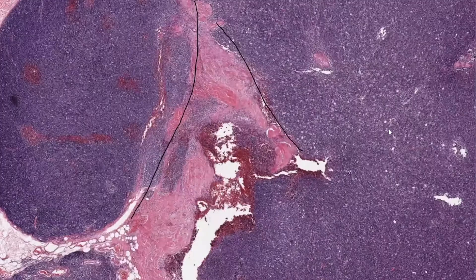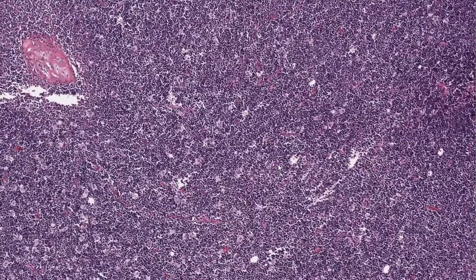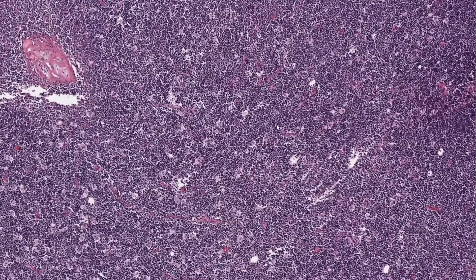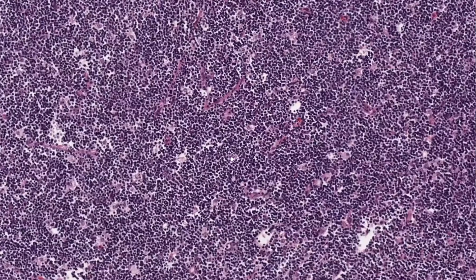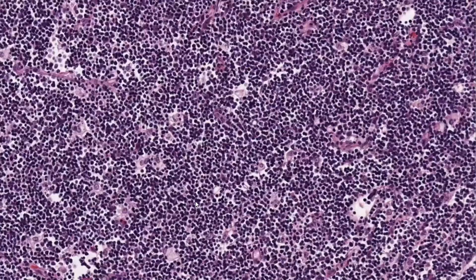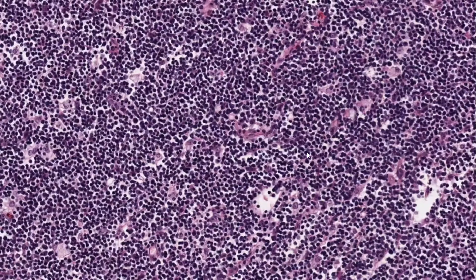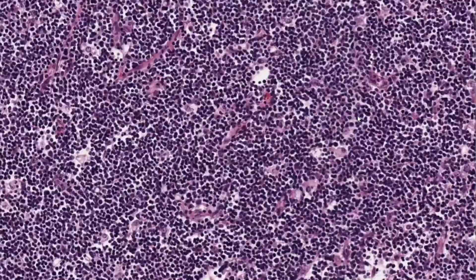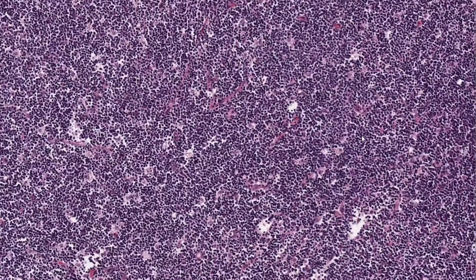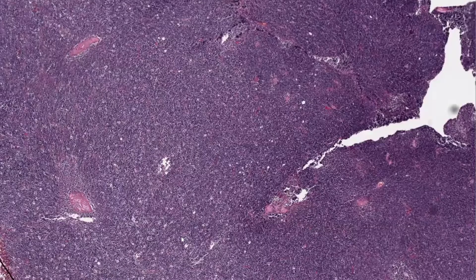In terms of thymomas, we subtype them in a WHO system into A and B thymomas. This is a B thymoma as we have numerous lymphocytes and interspersed epithelioid cells. This would be a B1 because we just see these single interspersed epithelioid cells and we're not really seeing clusters or sheets of epithelioid cells as we would see in a B2 or B3 thymoma.